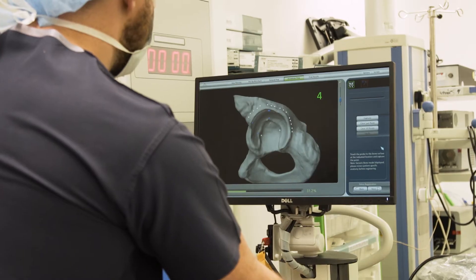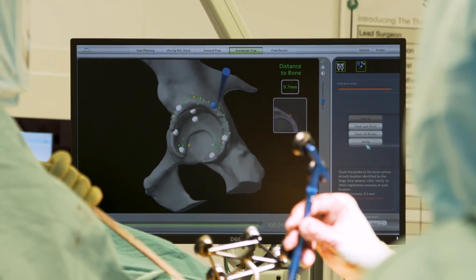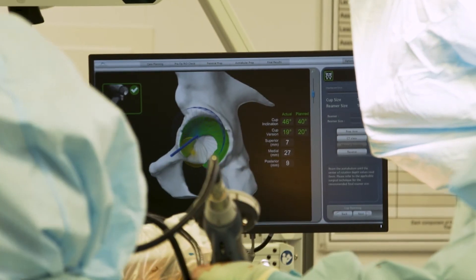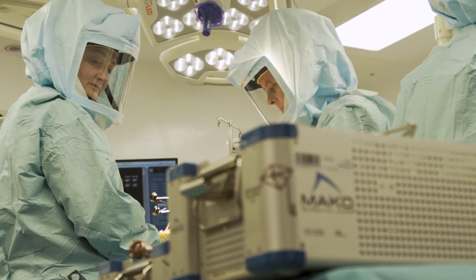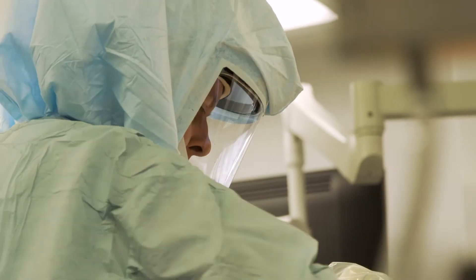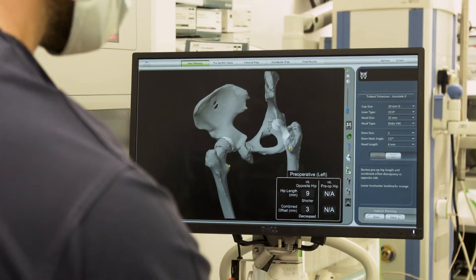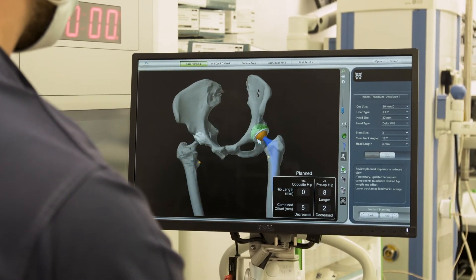Once we're inside the joint we take some reference points around both the socket and the femoral head. We then prepare the cup for the hip as per the surgical plan, and once that's done and we're happy, we implant the cup into the position that we want. We then prepare the thigh bone or the femur by placing the stem into position.